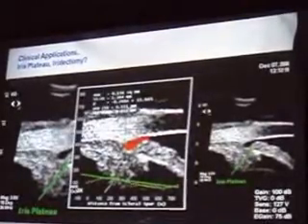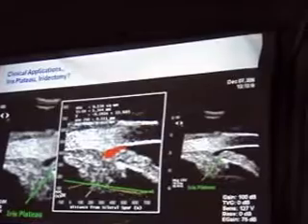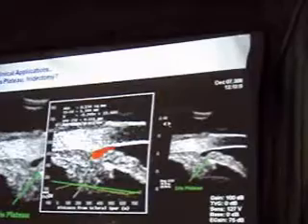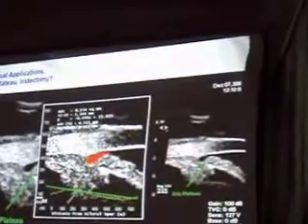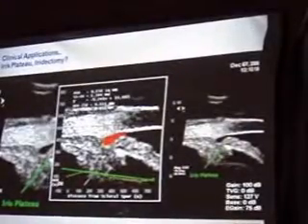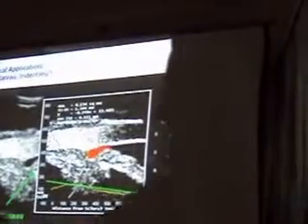In the last CIRO meeting in Edinburgh, Michel Puech from Paris presented a very interesting study about the incidence of iris plateau on the angle closed population, let's call it, universe. On many angle closes that you are going to be seeing in your practice by the slit lamp, 50% of them are going to have some kind of iris plateau anatomy, or either trend, and he classified it in 4 different ways. Here we have the Pro 2000 evaluating the iris plateau.